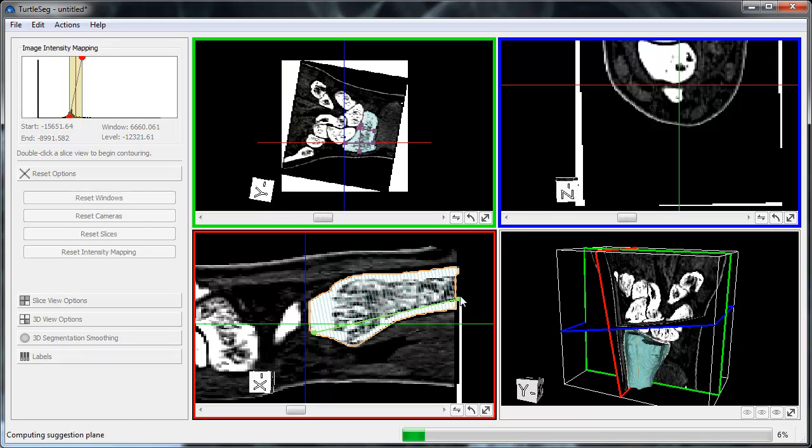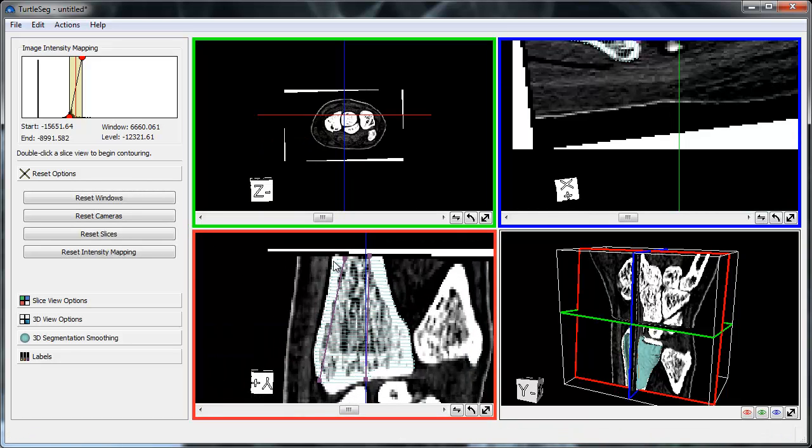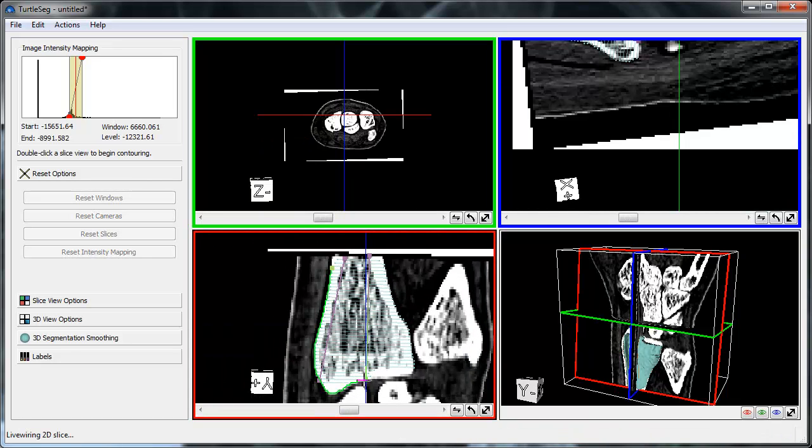We repeat this process a few more times, the segmentation quality improving over each iteration.